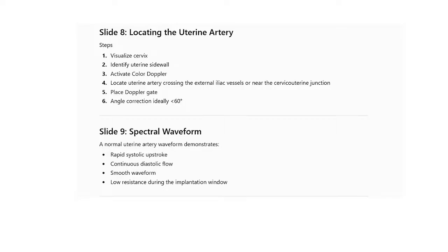So place the Doppler gate angle correction, ideally less than 60 degrees. So we are saying that the Doppler angle should ideally be less than 60 degrees.